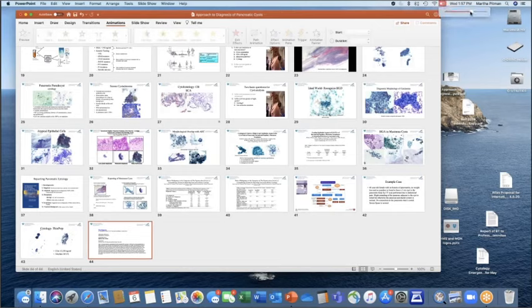First of all, do you have any adequacy criteria for pancreatic cysts, either in your practice or in the Papanicolaou system published book? No, there are no absolute criteria because we're using a multimodal approach, and I can make a diagnosis without any epithelial cells, like I said. So if I have thin, clear fluid with a CEA of 5,000, it's a mucinous cyst. If I have an acellular thin fluid with a KRAS mutation, it's a mucinous cyst. So cellularity is great if you have it, but it doesn't mean it's definitely non-diagnostic if you don't have it.